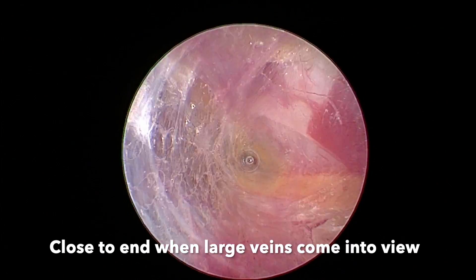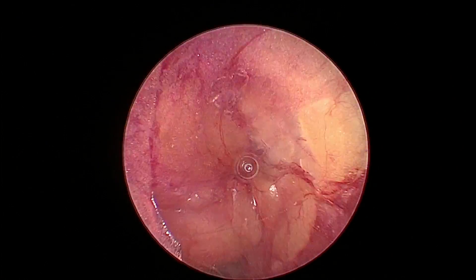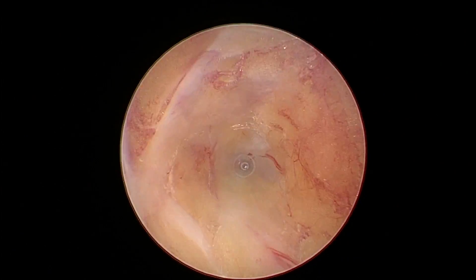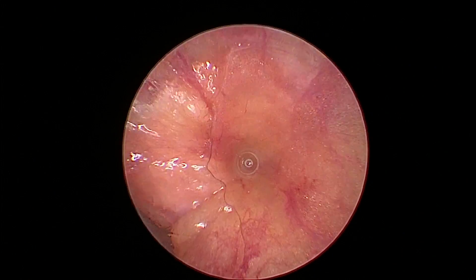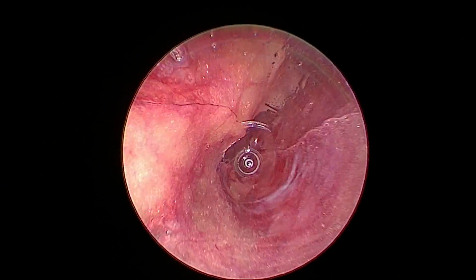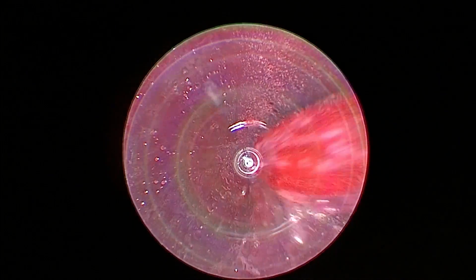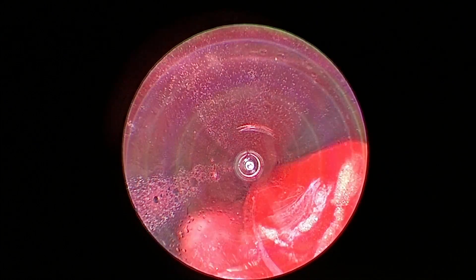Way lateral — you see these large veins come into view and you know you're at the end of where you'll be able to do your harvest. I noticed I was able to pass quite far up posteriorly, so I'm going to open this up a little bit more anteriorly because I have a lot of length with this radial — it was going to go on a circumflex, so you're looking to maximize length if you can. I'm cleared off posteriorly all the way up, now just checking lateral, looking for anything that might still be bleeding, and cauterizing any bleeding I find.